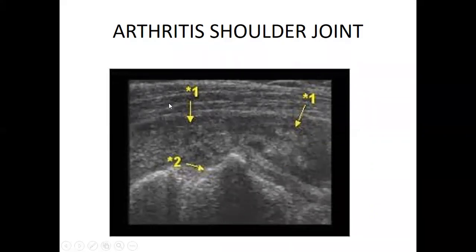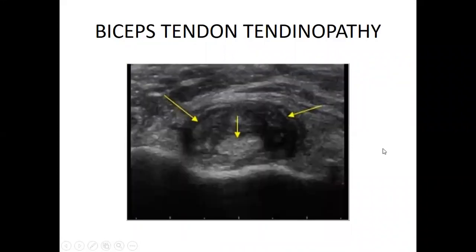Then that is our muscle above there, the deltoid muscle. Again, you have this biceps tendinopathy, within the tendon. You've got this deposition. These are degenerative. Remember, we said it should look echogenic, sitting within the bicipital groove. This is our bicipital groove. Which compartment do you appreciate this? Anterior compartment. You get the bicipital groove.